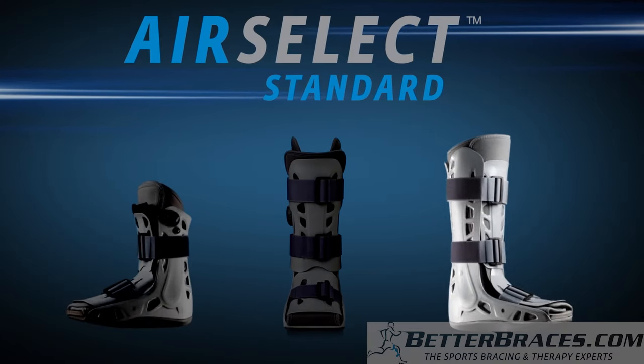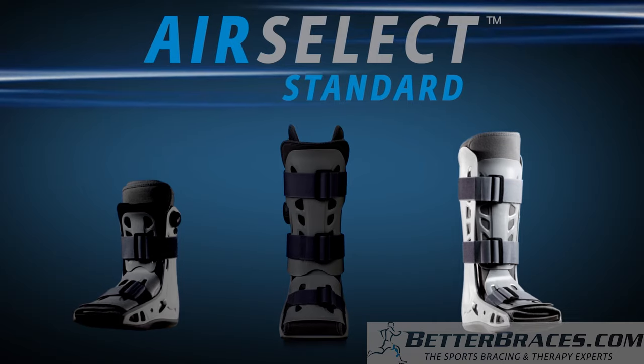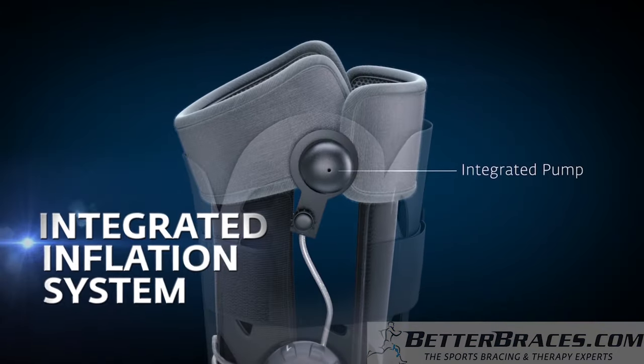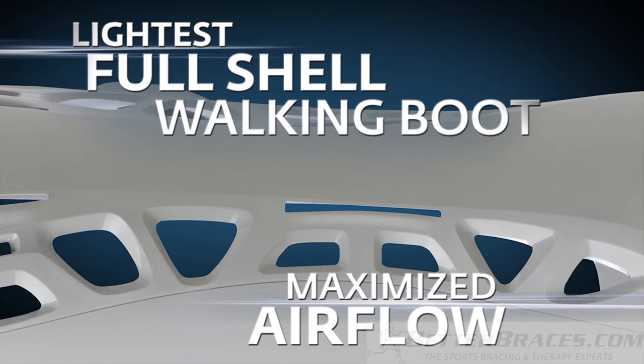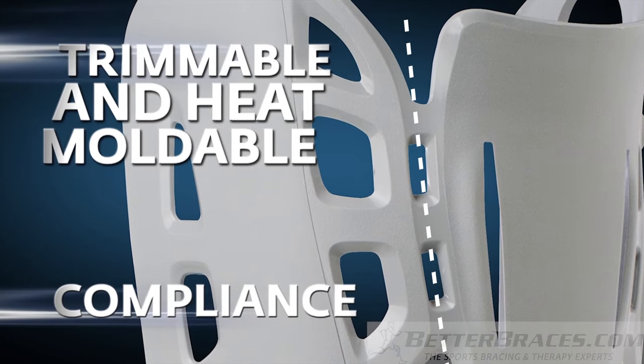The AirCast AirSelect Standard Walking Boot puts comfort, control, and healing in the hands of the patient with the most advanced pneumatic walking brace available. Using the AirCast Standard is as easy as preparation, application, adjustment, and definition.